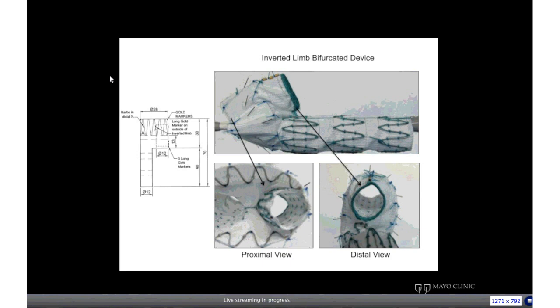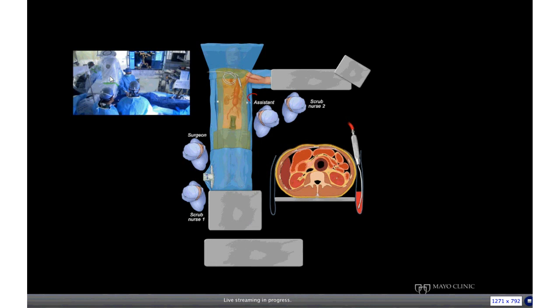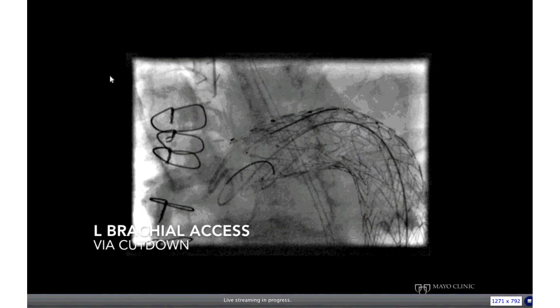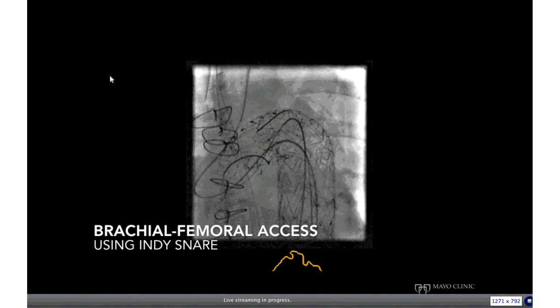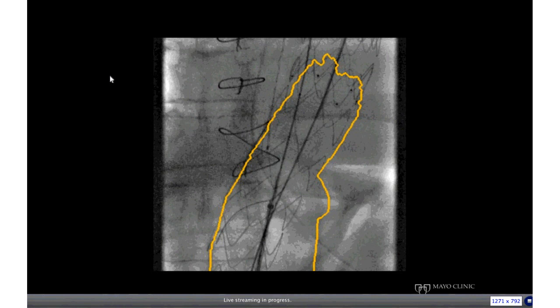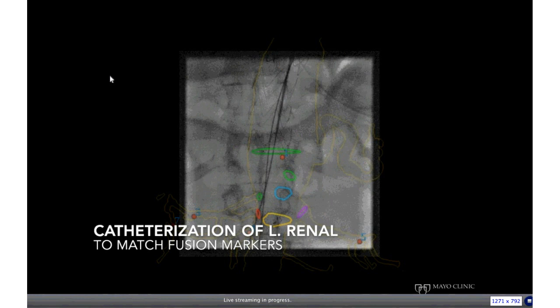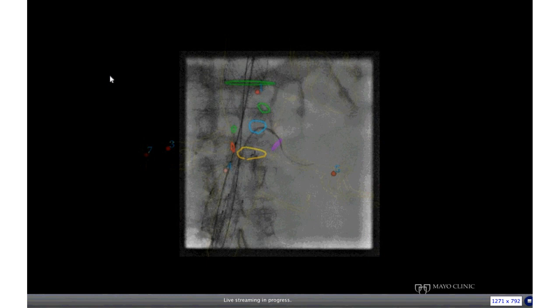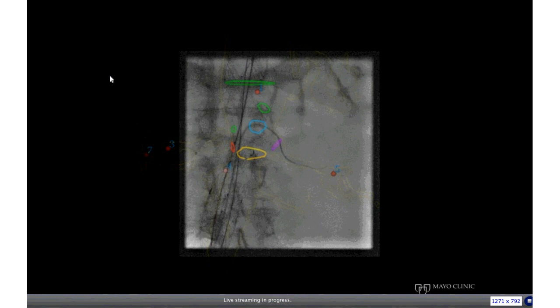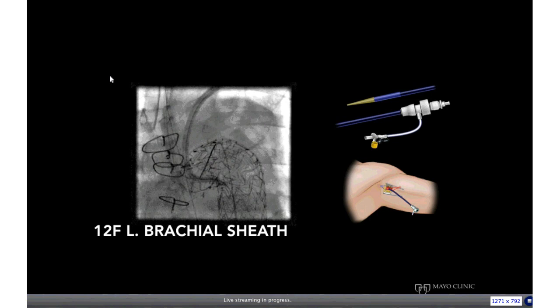The first stage involved redo aortic valve replacement and total arch using a frozen elephant trunk technique with placement of a C-TAG device by cardiac surgery. The second stage was completion thoracic and abdominal repair, extending repair to the celiac axis. The third stage repair used a combination of branches for the celiac and SMA and fenestrations for the renal arteries — a novel design with a new delivery system with preloaded wires on each branch and fenestration. The procedure was done in the GE hybrid operating room with a total percutaneous technique. Percutaneous access was established at the right femoral artery and left brachial axis, and a wire was advanced to the thoracic aorta.